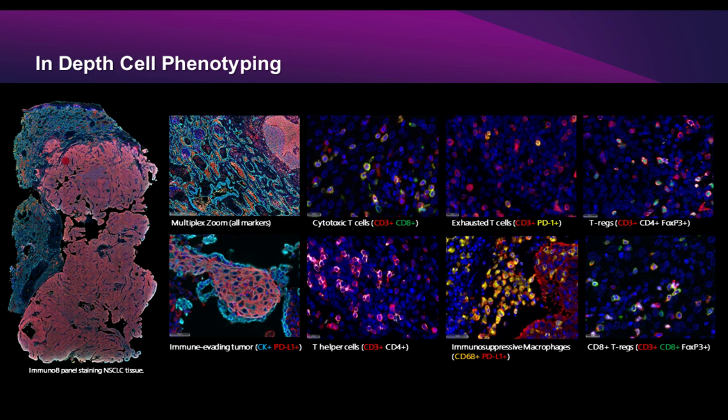And also by using fluorescence, you have a higher signal to background ratio, meaning that even if you do have very slight or faint artifacts, that signal is generally so low it's not being picked up by any analysis algorithm, and it's something that you really visually can't even pick up on compared to the bright intensity of your positive signal.